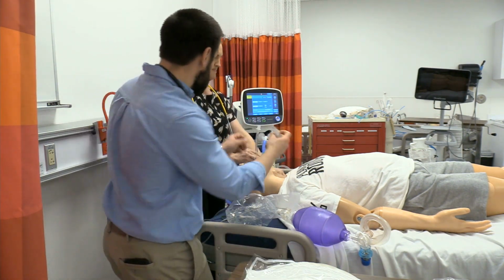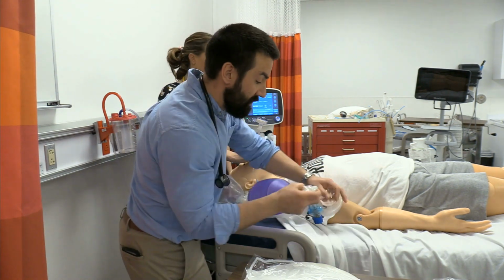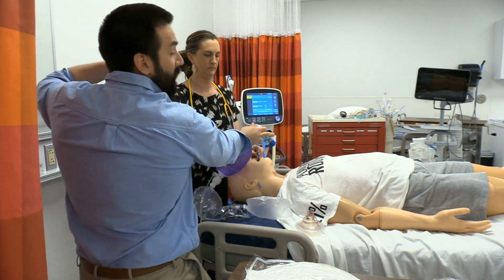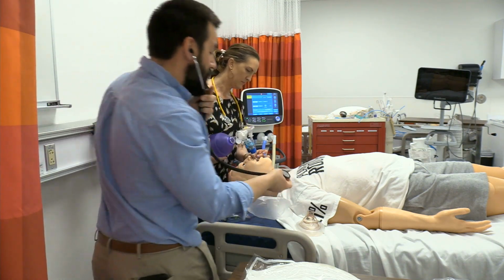I'm going to take the CO2 here, place that right on top of the 15mm adapter. I'm not going to go far with my mask. All right, go ahead. I'm going to listen here. We'd have somebody else. First, auscultation over the stomach.